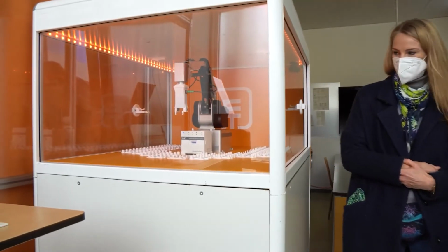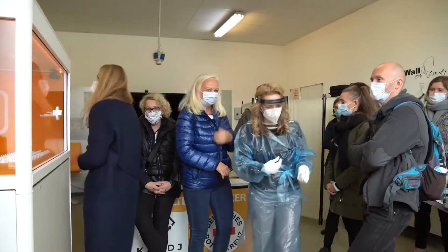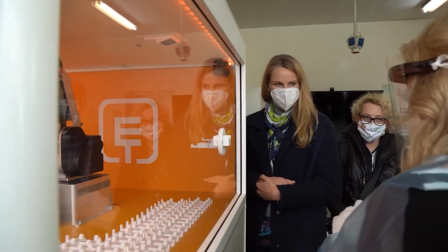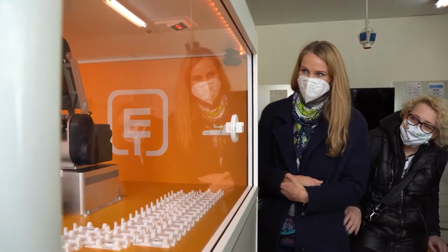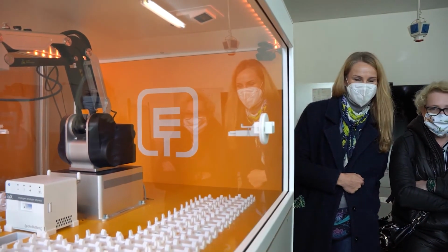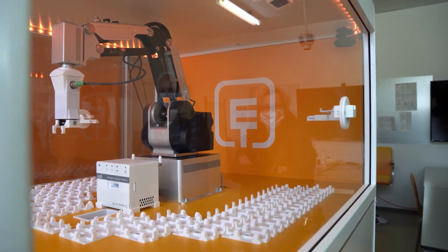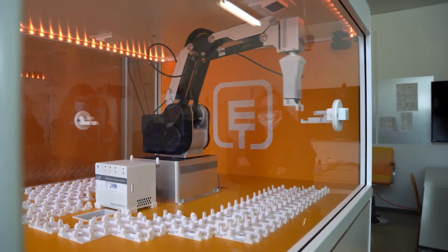I would like to show you a little bit what happens if you put it in the wrong way. Sometimes we have a lot of people and we don't look. Normally you have to put the barcode at the front inside. And if you don't remember it, then you put it inside, and it will take a little bit of time, but it will recognize that we have put it wrong and tell us. It takes normally approximately 10 seconds. Okay, so I have to do it again.